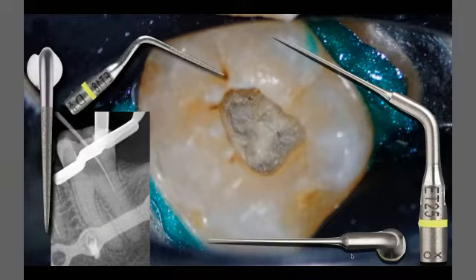But the problem here is that the calcification goes inside the root canal also. So here we have obliteration and dystrophic calcification inside the root canal. I also have to trap and break up the calcification inside the root canal with thin, non-coated ultrasonic tips.